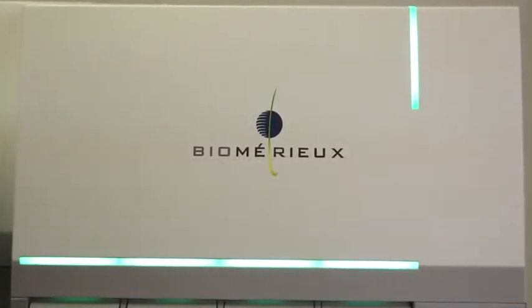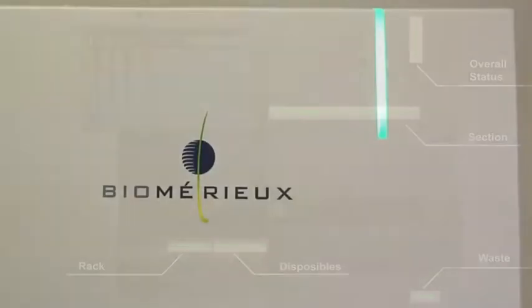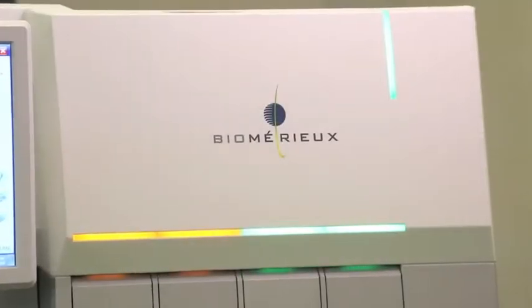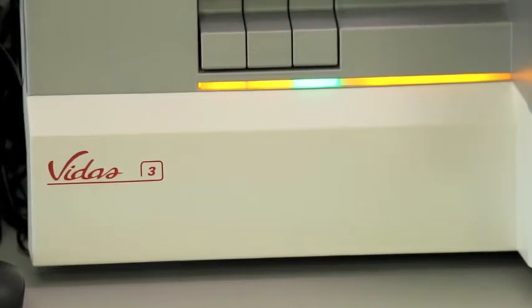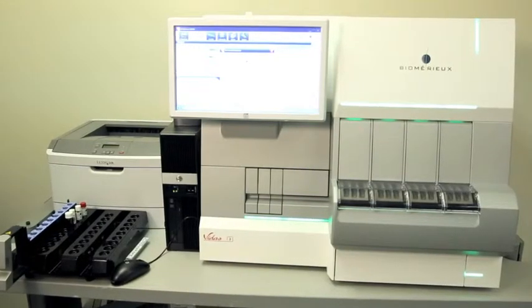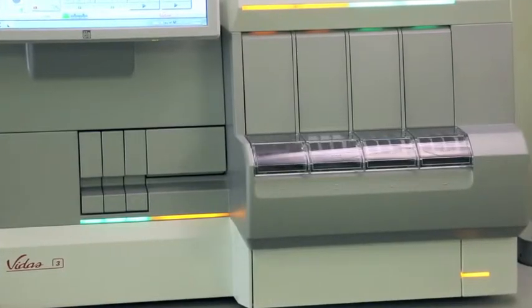Now, let's discuss the LED bars. Each area has its own LED bar to show its status. If the LED bar is green, the section is operating well and can be accessed. If the LED bar is yellow and flashing, the section needs attention but the error is not critical. If the LED bar is yellow and solid, the section is being used by the analyzer and should not be opened. If the LED bar is red, there is a critical error present. These indicators can be seen throughout the lab, which allows the technician to see at a glance the status of the analyzer and whether it needs attention, improving efficiency and workflow.